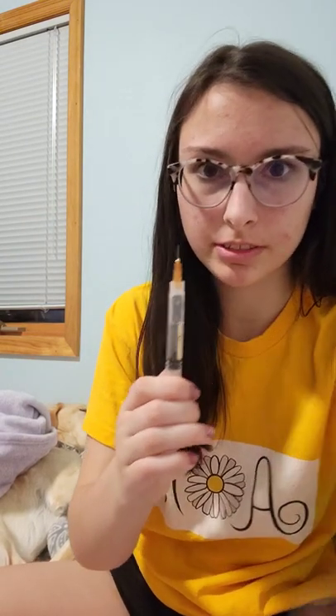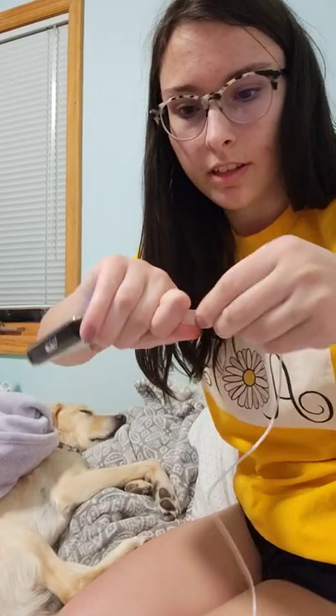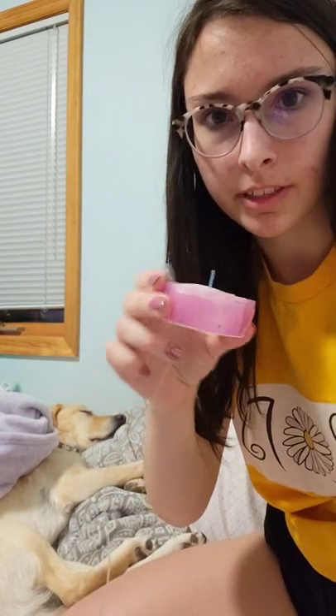Gotta flick out the bubbles. I can really smell the insulin. Taking out the old cartridge and putting the new one in. Then I just have to connect these and then wait for a little bubble to appear at the top of that.